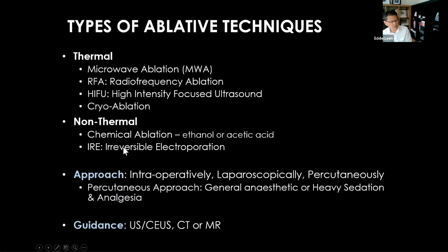Now we mostly use this ablative technique percutaneously, but obviously we do have surgeons that do it intraoperatively or by laparoscopy. It's done under general anesthesia in our case, or it can also be done, especially for the liver, under heavy sedation if we don't have the facility of general anesthetic in the department. And for guidance, ultrasound and CEUS is most commonly used, although we can still use CT or MR in very tricky cases.